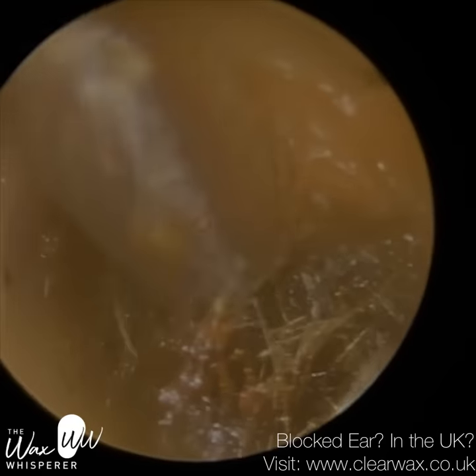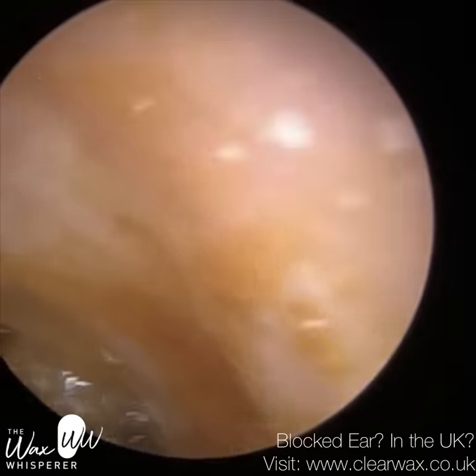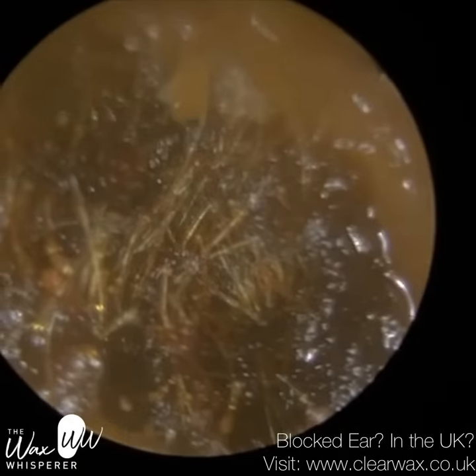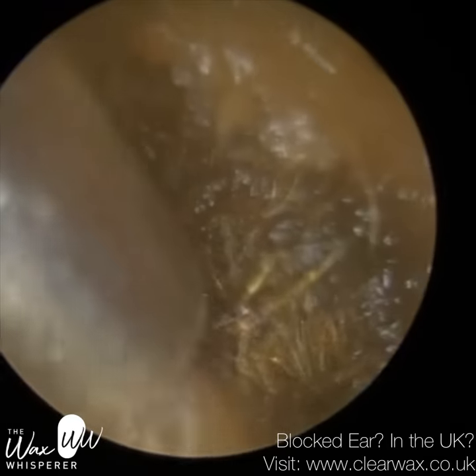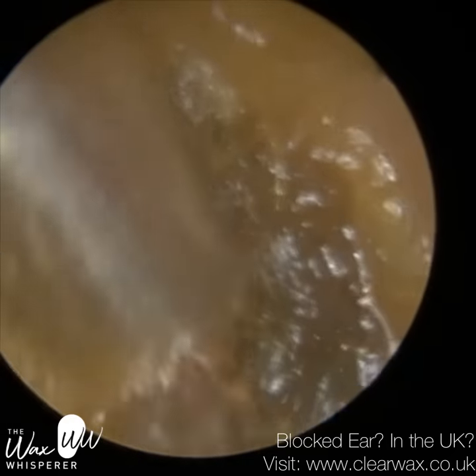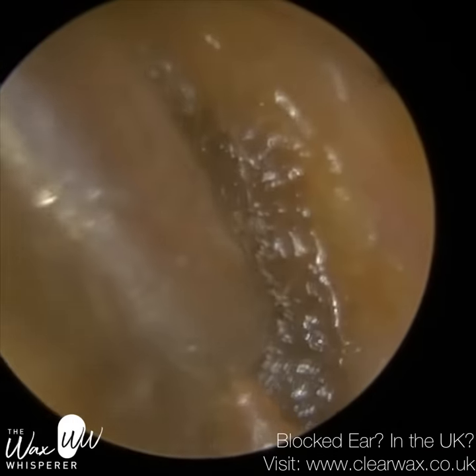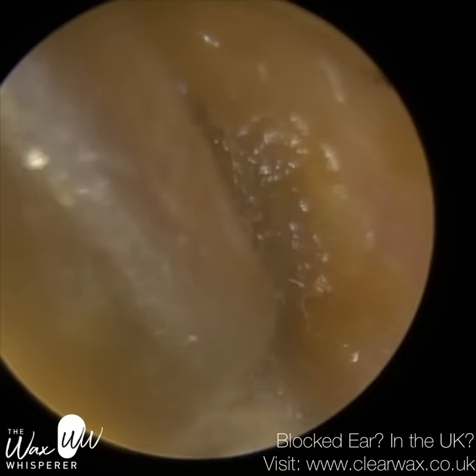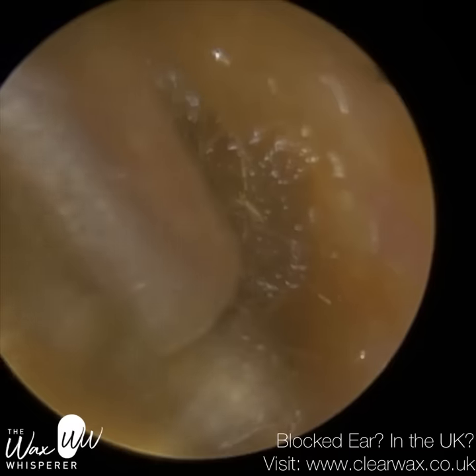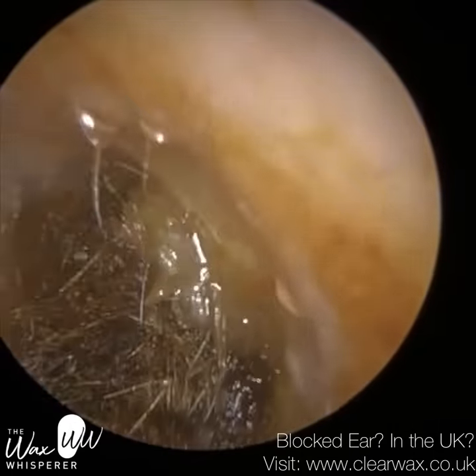I think this is where the patient started talking a bit more here. So I just had to, at that point, come out and explain that when they were talking, their jaw moving was pushing the wax out. Quite often I'm having conversations with patients. Sometimes I think, why am I? Because I'm not sure they can hear me with the suction probe in. But some patients, the jaw just doesn't affect their ear. But with this particular patient, it was making a big difference. And slowly we're loosening that.